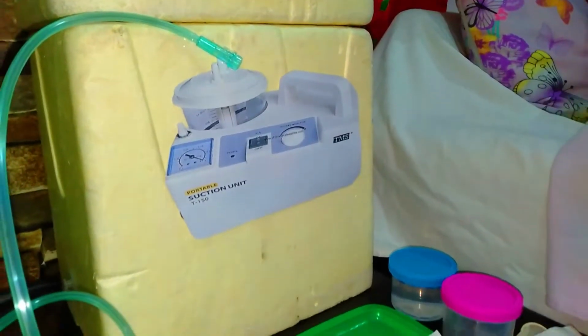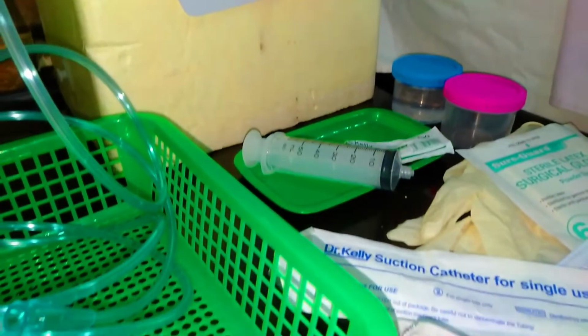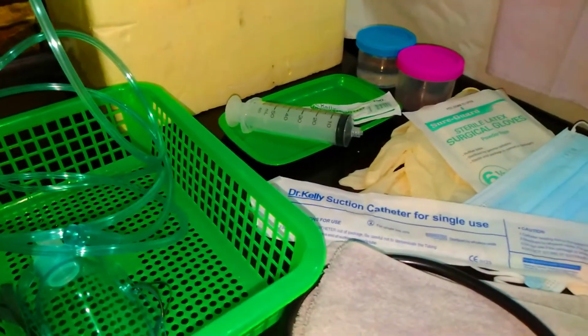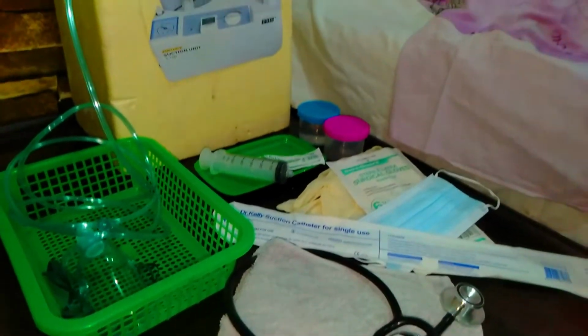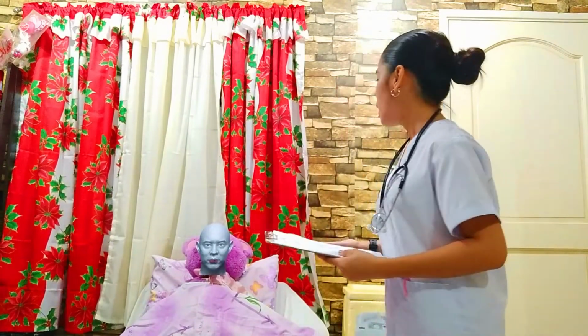The first procedure is to gather the supplies. The next is we need to perform the following safety steps. First is to check the room for transmission-based precautions. The next is we need to perform hand hygiene.